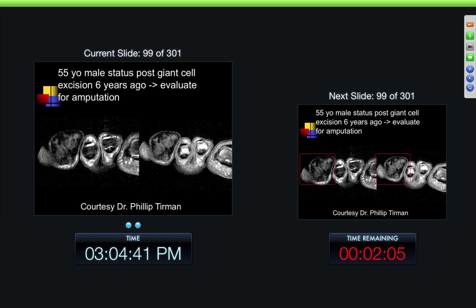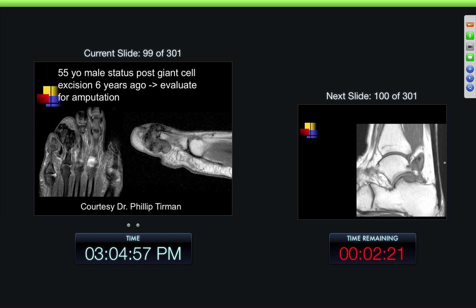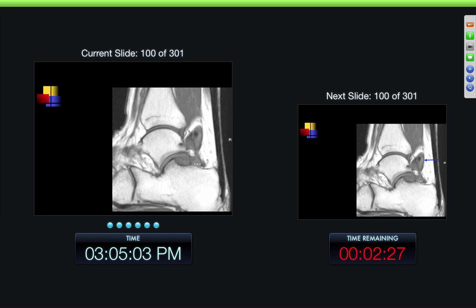Here's a 55-year-old male, status post-giant cell excision six years ago, now being evaluated for possible amputation. Here we can see this large inhomogeneous mass with a lot of low signal intensity within it, compatible with a fibrous-type lesion. Here we can see this large mass also with destruction of the bone adjacent to it, and this was a recurrent PVNS from incomplete resection before — they just wanted to stage it.